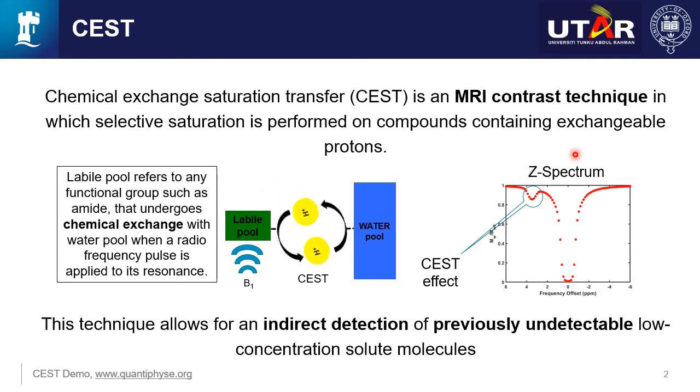And this CEST effect is what allows us to indirectly detect previously undetectable low concentration solute molecules. And the reason why this is very useful is because it allows us a non-invasive way to measure biophysical and physiological properties. And this has a very broad range of applications.